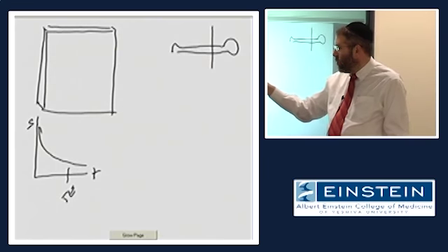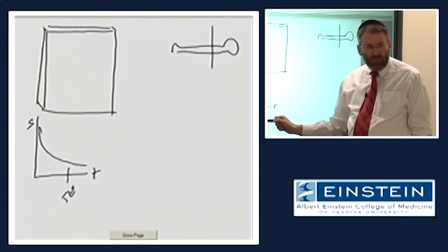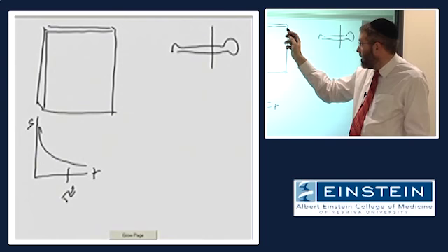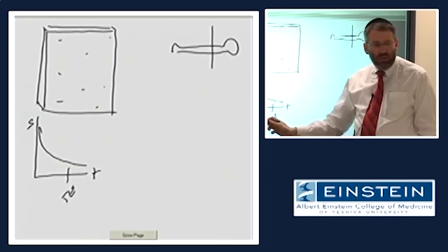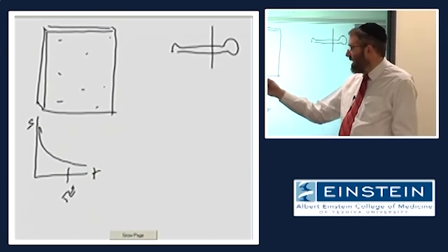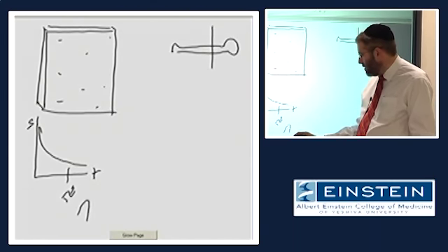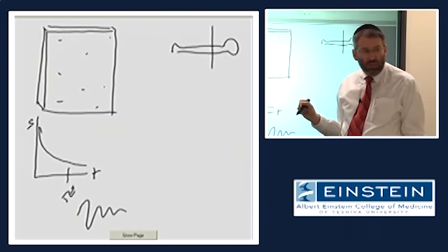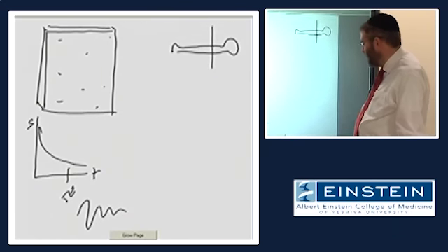But I have absolutely no way of telling you where in this slice that signal comes from, other than that it comes from everywhere. Right? And in fact, this slice is an aggregate of whatever is within the slice. Everything altogether is expressed in this aggregate signal. What we have to do now is take this signal and split it up and determine which components of that signal, that thing that we looked at earlier, come from which locations in the image. All right? So this is the approach that we're going to take.